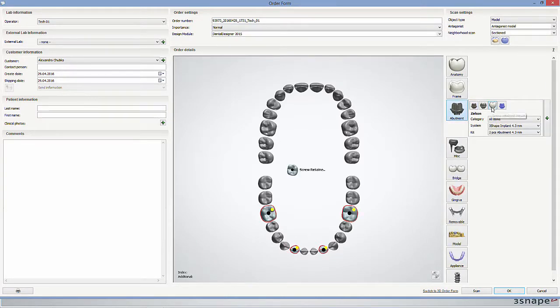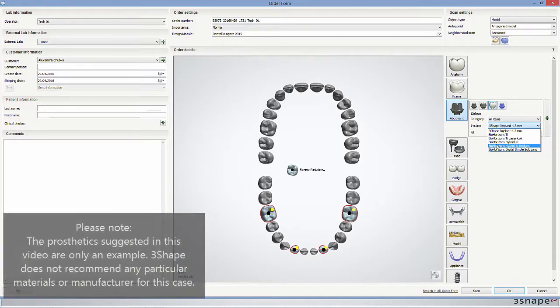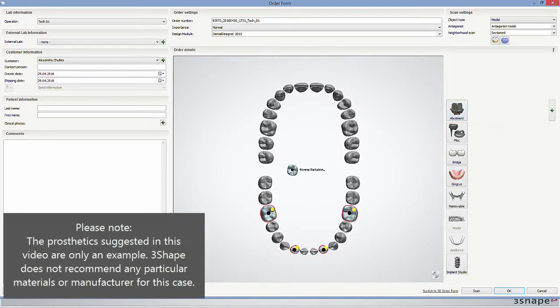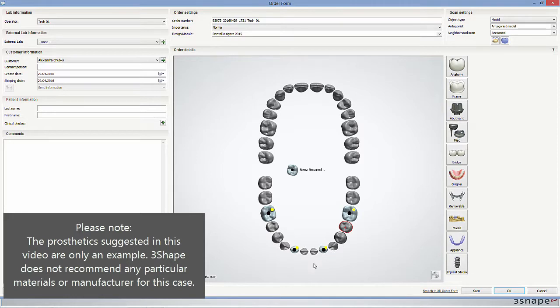Then you add the appropriate prosthetic indications. Please be aware that the prosthetics suggested in this video are only meant as an example and not as a recommendation.